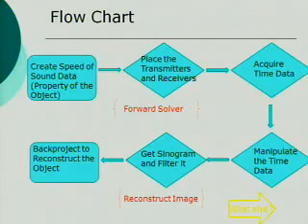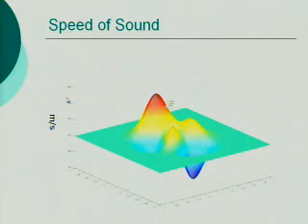Here is the detailed procedure. So first I create the object. Here is how I did it. It's a 400 by 400 points matrix. It's a 2D object. So if we just choose a point, like this one, the x and y value of that point represents its spatial location in 2D space, and the z value represents the speed at which the sound wave propagates through that point.